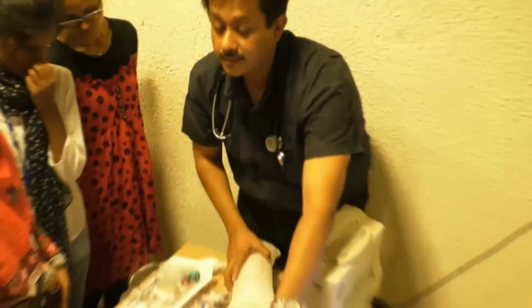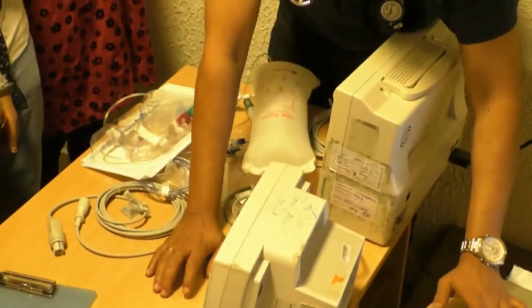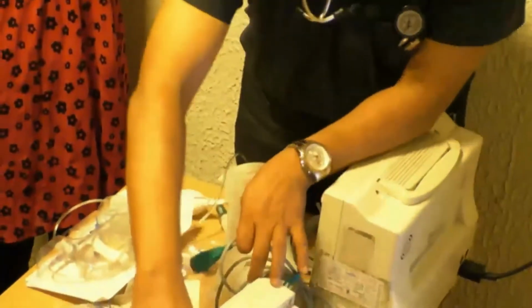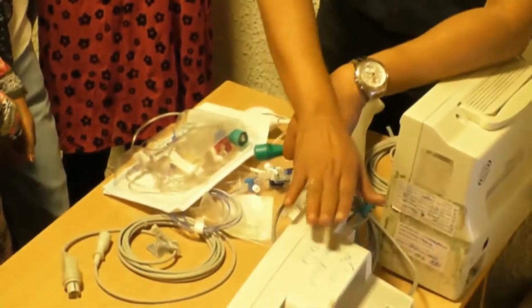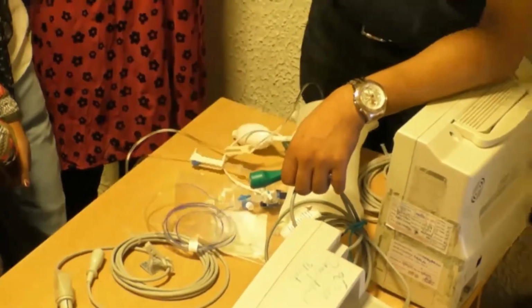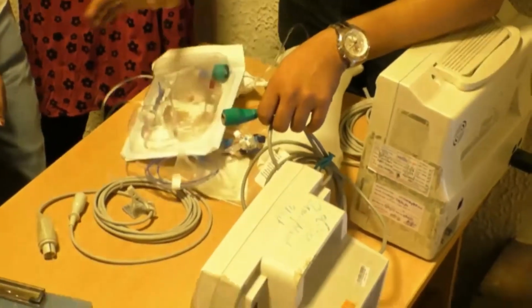Flow, which I had discussed earlier. In CMRI also maybe there is a flow track. In our hospital also we have a flow track. This is where it attaches to a central venous catheter, and there is an option for attaching another wire to an arterial line. This is a flow track transducer.